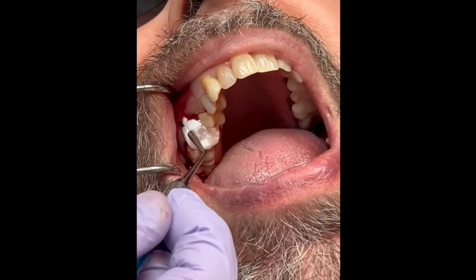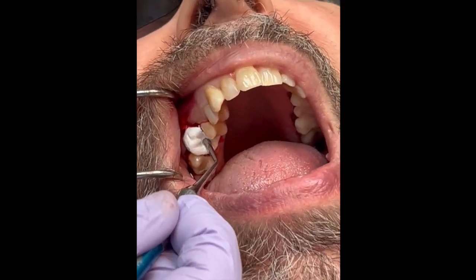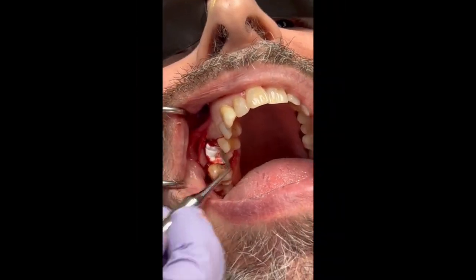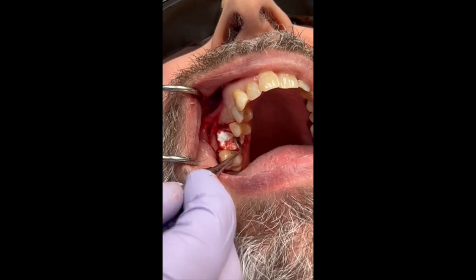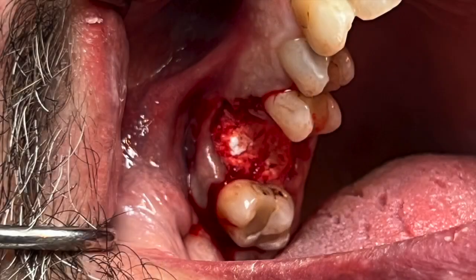We tell the patients that it is white in color — if they see something white, it's not infection. We will allow the epithelium, which grows a half a millimeter to a millimeter a day, to close that site.